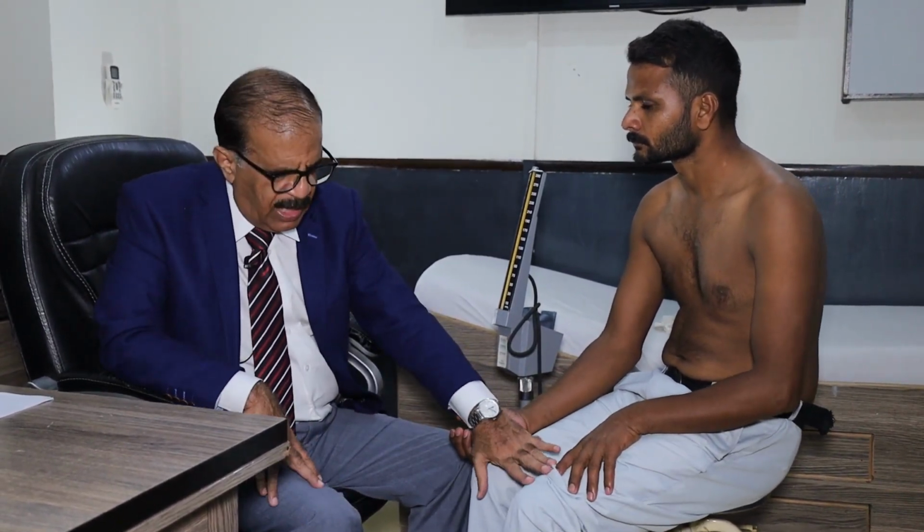And patient should be sitting like this, and I think best is both legs hanging and resting on the floor. Patient should be sitting comfortably, ideally with a backrest, but since there is no backrest here, I think this is also okay. Patient should be relaxed. Patient should not have eaten or taken food immediately before measurement. Patient should be resting for at least 5 minutes, because even if you do little movement, you get up and put the light off or on, your heart rate goes up, your blood pressure goes up. So when you are measuring blood pressure, patient must be seated for at least 5 minutes, and he's been seated for more than 5 minutes, so I can go ahead with measurement of blood pressure.